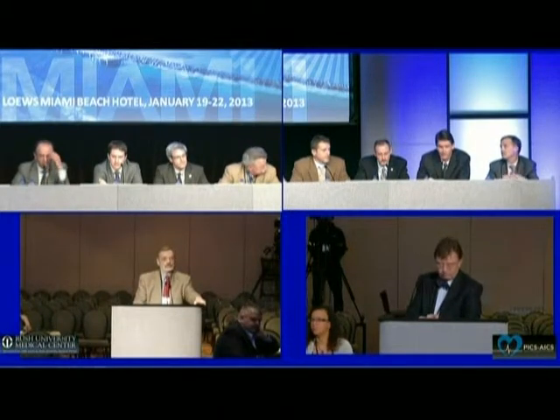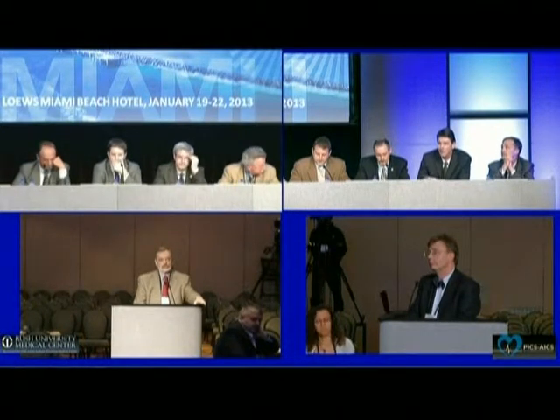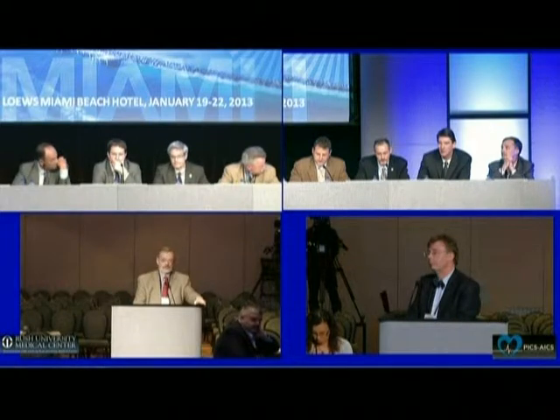Could I just add one quick comment with regard to this gating acquisition mode? This is something which we've offered for some time, and it's been adopted by a few institutions, but for all the stated reasons, it's not the most popular. In order to get enough projections for a meaningful data reconstruction, you really have to do multiple sweeps, and this adds to the acquisition time, which is the biggest challenge. Certainly you can gate, but because gating on a single sweep doesn't give you enough data points, you have to make 4 or 5 sweeps, so it's not that well received.